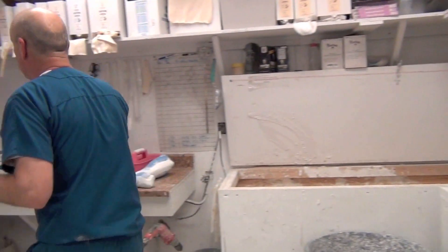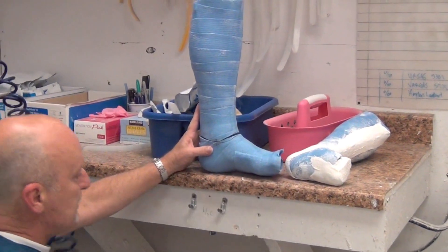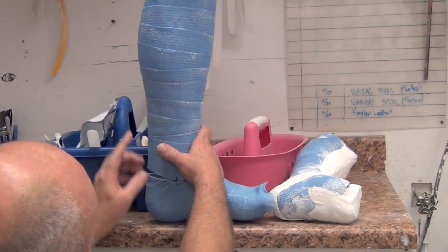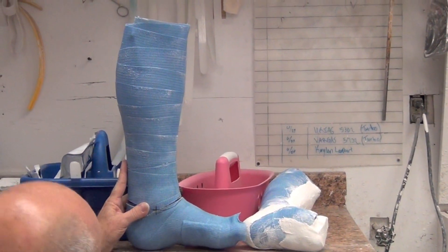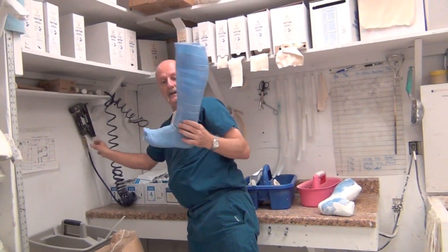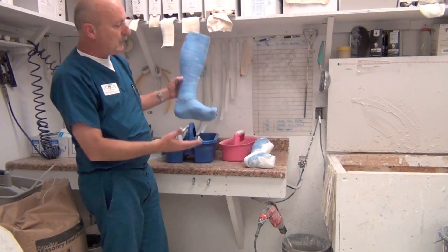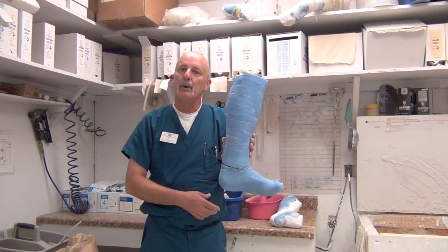What I want to do is angle it so that it hinges at the ankle. I'll come over here and check my angle. For me, I basically want the posterior aspect of the heel to be slightly anterior to the posterior aspect of the calf — not much. Now it's ready to be poured. It will be more dorsiflexed when it's finished because I'm going to flatten this out some. Now it's ready to be sealed and poured.